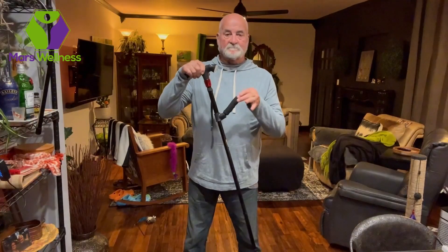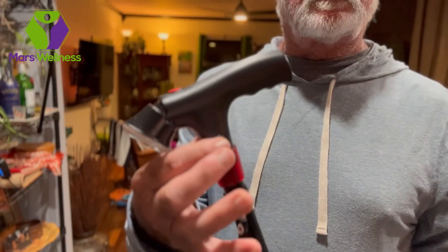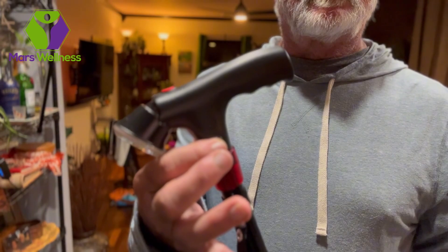Experience comfort with the second handle. It's designed for easy grip and support. Stay safe with the built-in alarm — just press away for peace of mind.